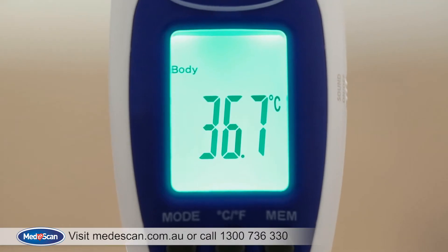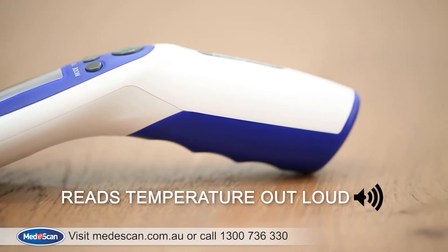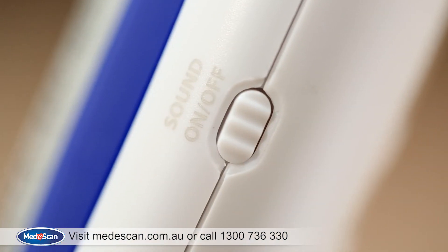The thermometer will display the temperature on the screen and will also read it out loud, which is perfect for visually impaired users. You can mute this feature by pressing the white button on the side.